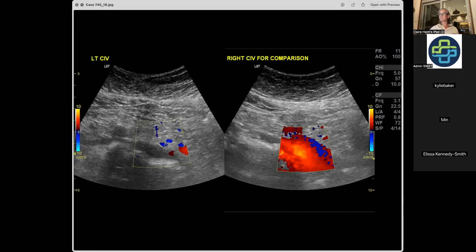I usually don't do just a 2-point, but say in the setting of a cardiac arrest or peri-arrest patient where I'm thinking they might have a DVT, because if I diagnose that, it makes the presumptive diagnosis of their arrest or hemodynamic state pretty definite. Somebody comes in, collapses, is hypotensive and has a DVT, most likely they've just had a massive PE.